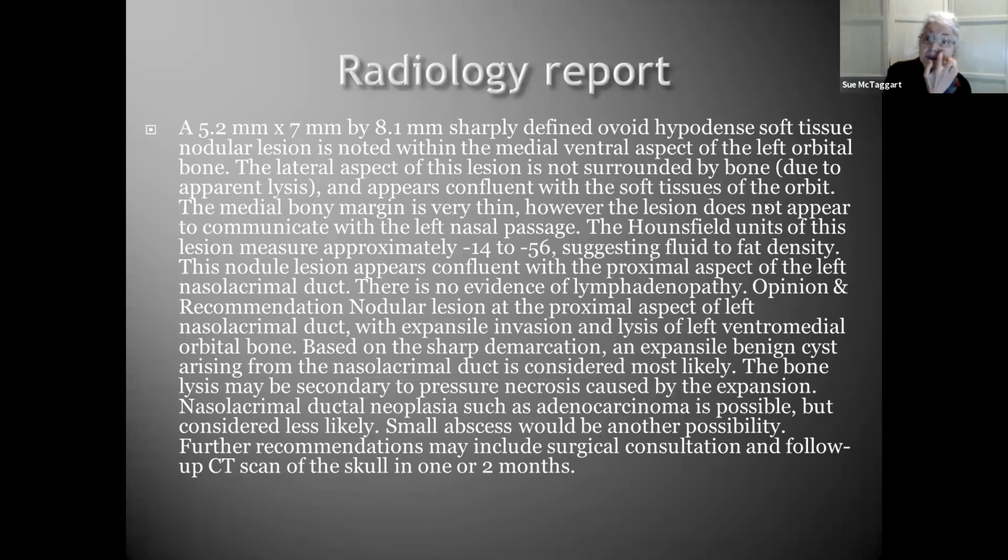So you can send your images for a detailed report from a radiologist familiar with reading cone beams, but you know, many of them you can quite quickly become proficient at reading yourself. And it's really an awful lot of fun. You have to drag me out of there.